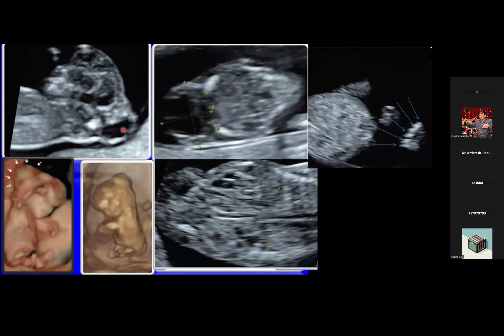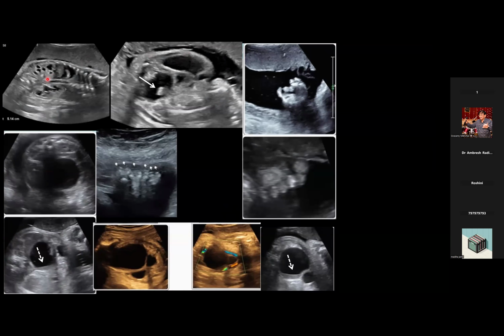So this is encephalocele, cystic encephalocele with polydactyly and bilateral enlarged cystic kidneys, Meckel-Gruber syndrome. So this was the case of bilateral hydroureteronephrosis. This is the bladder, and posterior to the bladder, there's a cystic lesion with the echogenic structure within. So this was the fluid-filled distended vagina, and this echogenic structure was the cervix.